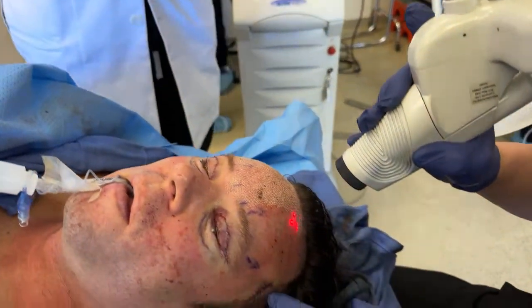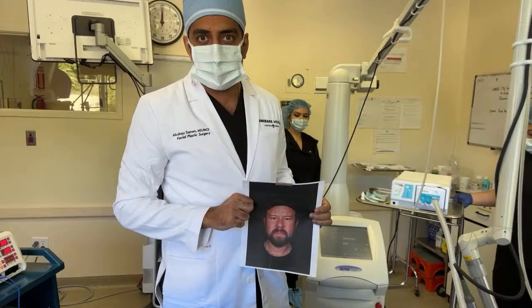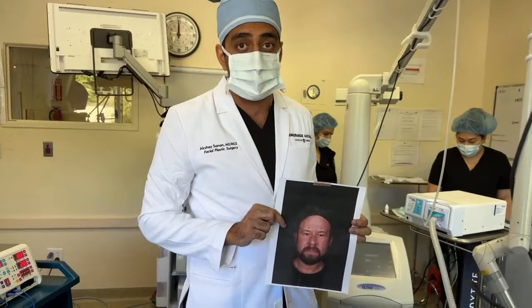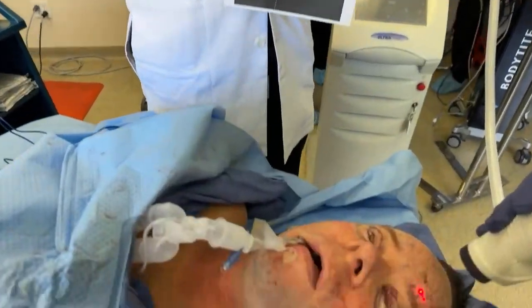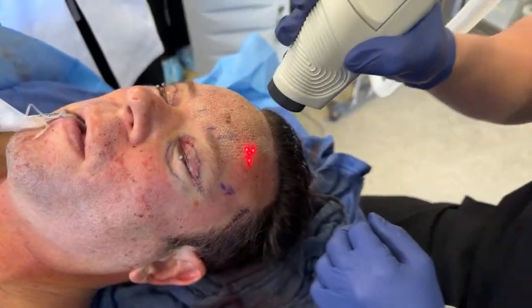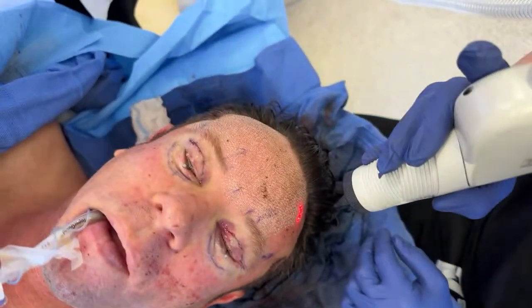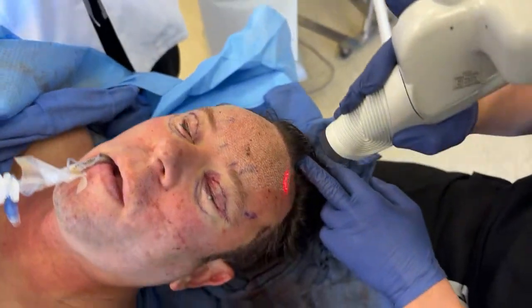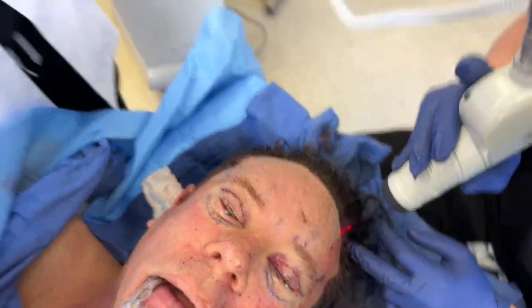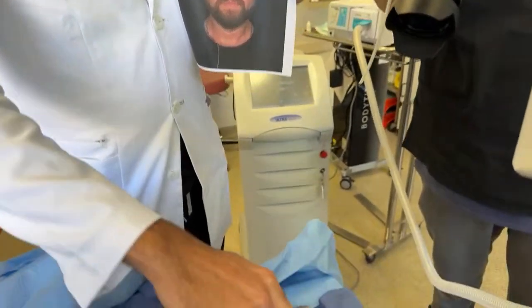So tell them what endoscopic is, because they might not understand what that is. So endoscopic brow lift means it's a minimally invasive brow lift. I use a camera to clearly dissect in the appropriate plane, lifting up the skin and the muscle of the forehead away from the bone, and I lift it up in a very minimally invasive way, so it's very gentle on the skin. You can tell it's barely bruised, and you can't even see the incisions, and they're two corner incisions. I lifted the brow centrally and on the corner to make it higher, but also more horizontal. As you can see before, very downturned, and now you can tell that the middle of the brow is lifted.